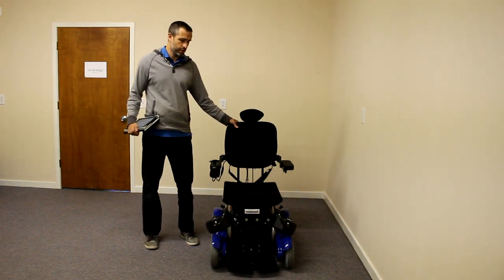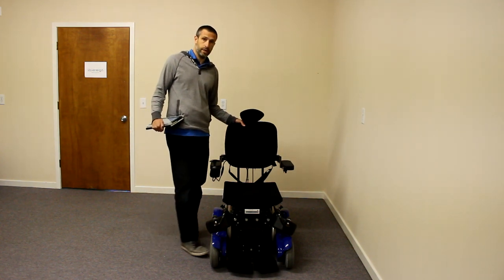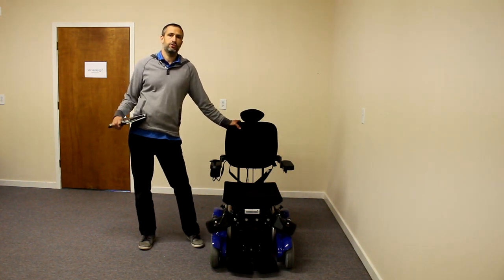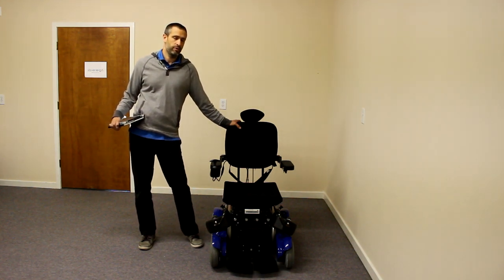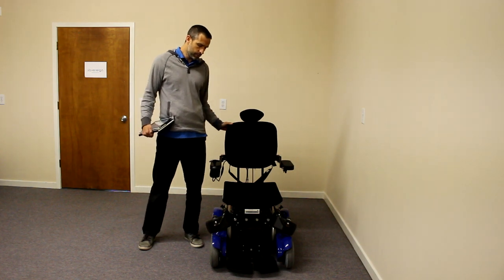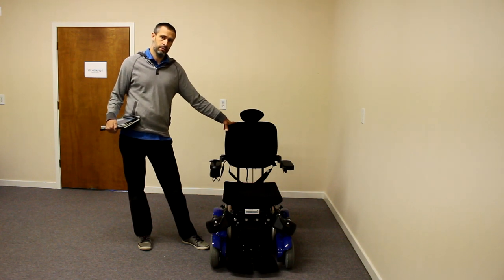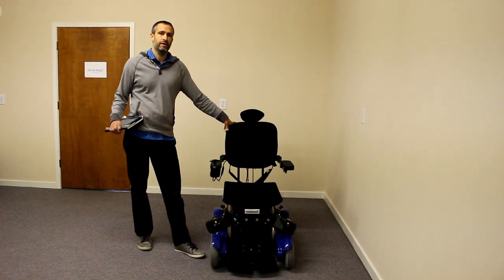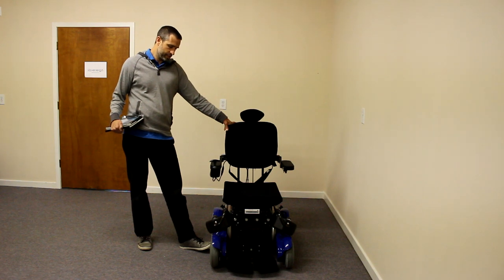I really like a few things about this chair. I like how it offers the only mid-wheel drive base in the market that has a power standing feature. I like how it goes down to 12.5 inches small — I think it's the smallest power standing wheelchair in the market. The base is really cool and unique. It is a mid-wheel drive base, and it has what they call a dual drive system, where you have mid-wheel drive in a seated position.